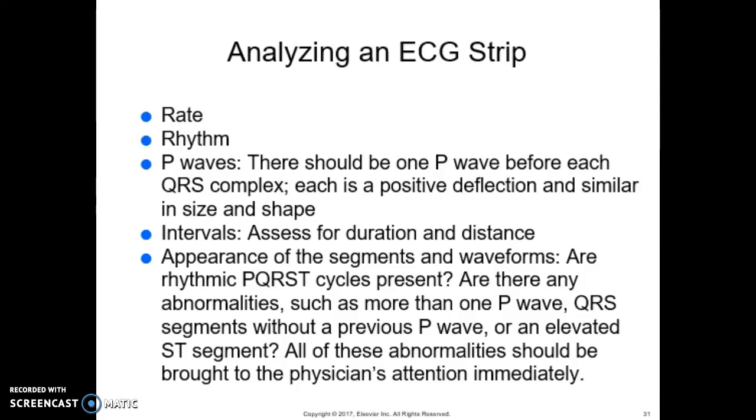So are rhythmic PQRST cycles present? Are there any abnormalities such as more than one P wave, QRS segments without a previous P wave, or maybe an elevated ST segment? All of these abnormalities should be brought to the physician's attention immediately.